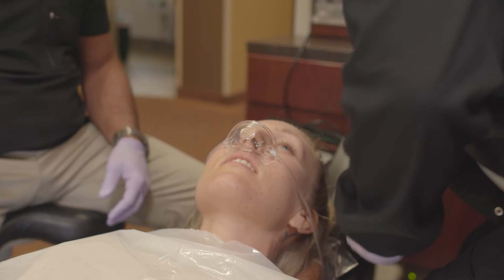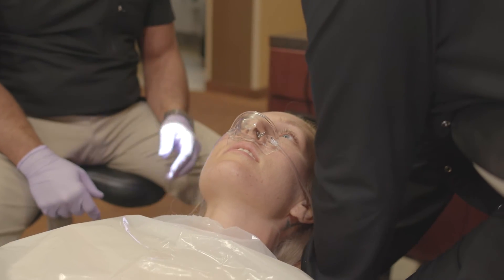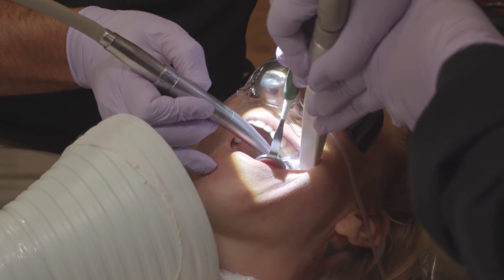Number two is that we have a certain hood that we place over your nose, which you breathe through exclusively, so that none of the harmful vapors or overspray can enter into your nasal passages.